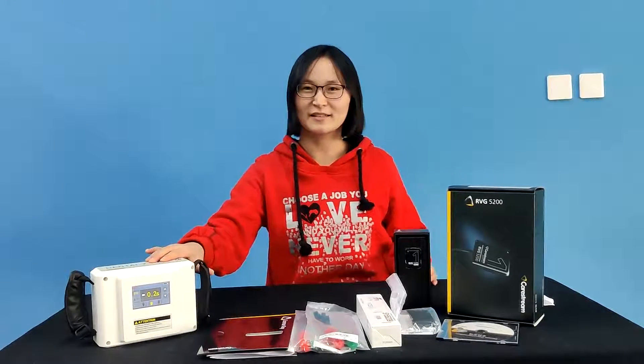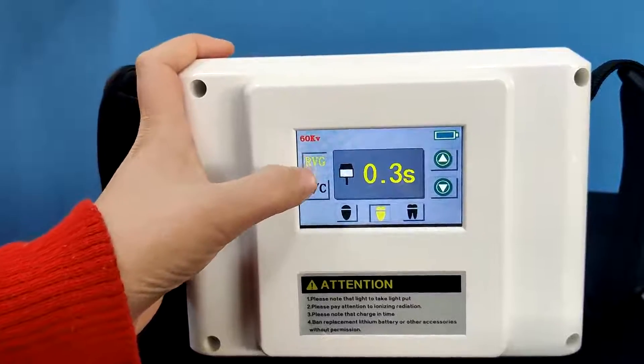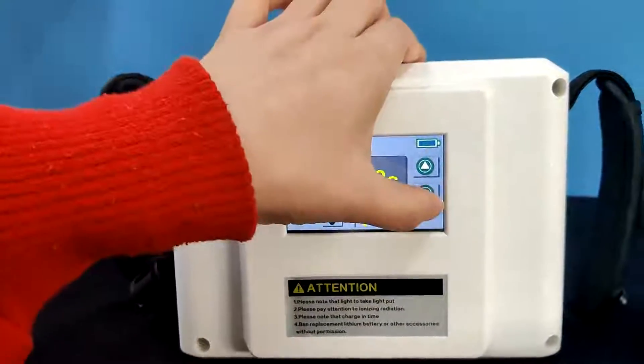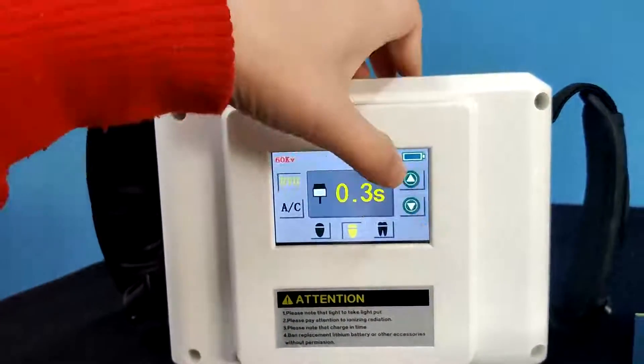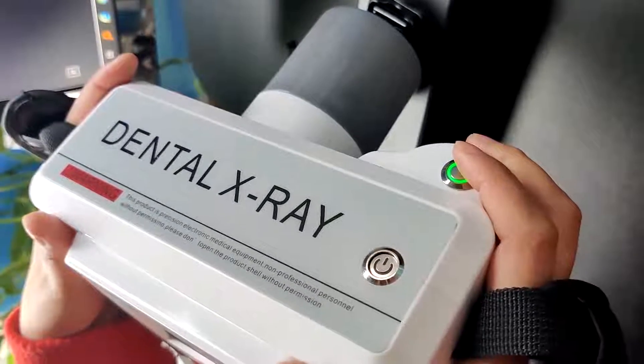Now let's work together. Select film mode or sensor mode — choose the sensor mode. Adjust the time. OK. Push this key to take the picture.